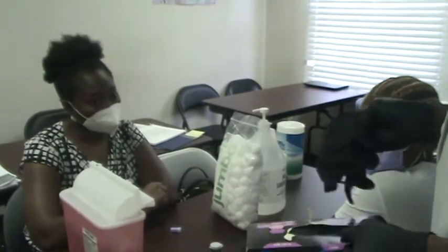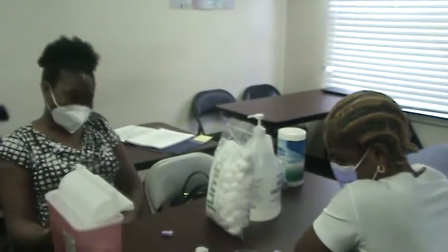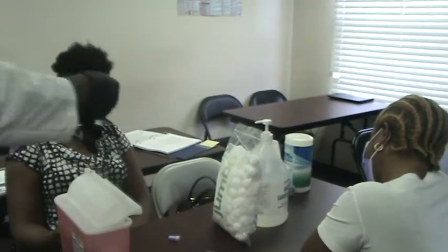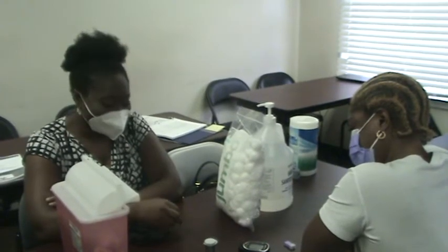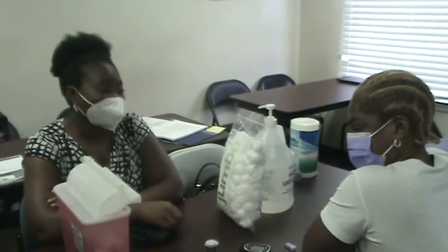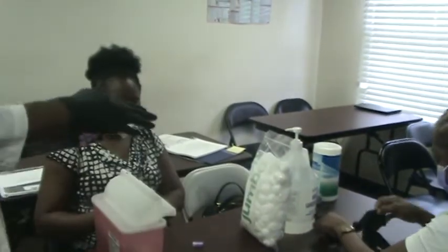So who's gonna go first? Doesn't matter who goes first. There's gonna be a returning of the favor. There'll be a return match. So if you stick too hard, then you know she'll be coming for you. Alright, so you want her to stick you first. Okay. So then you put on your gloves. So when she's done, don't put yours on because she will do it.